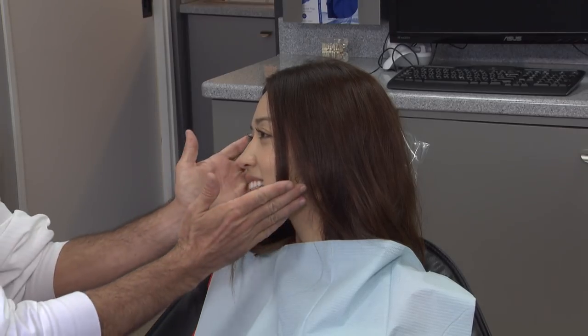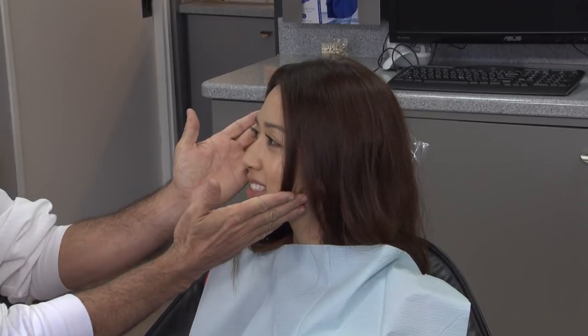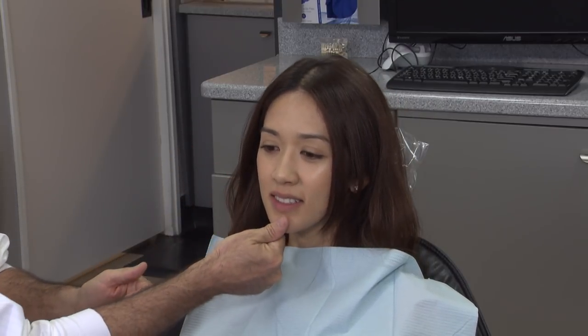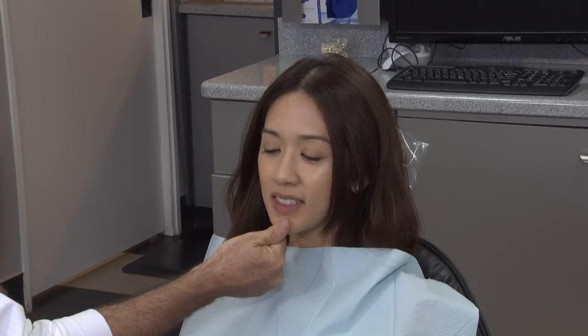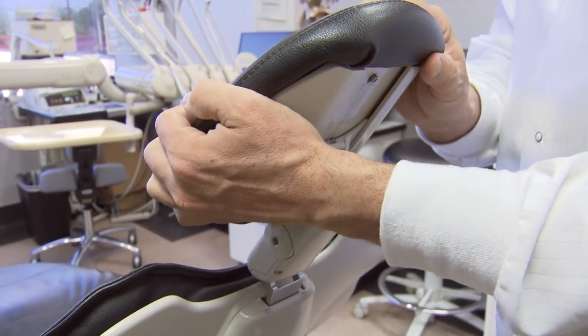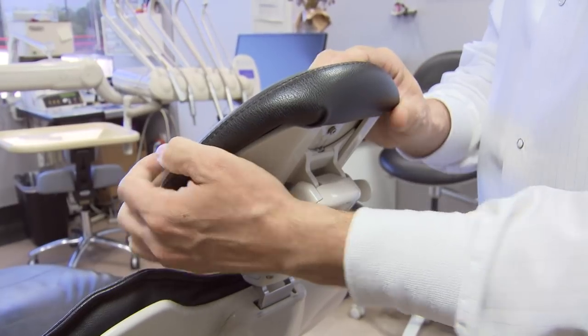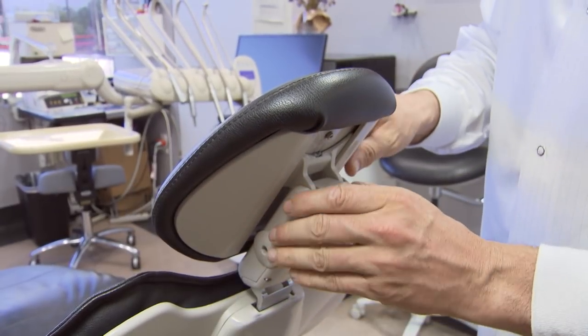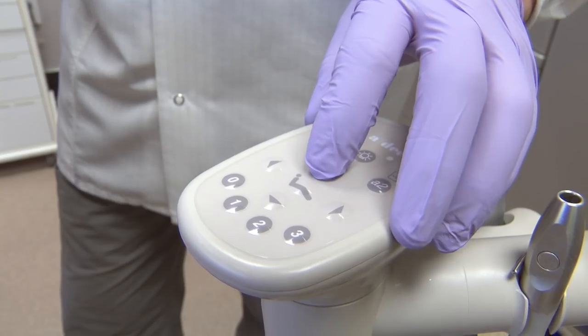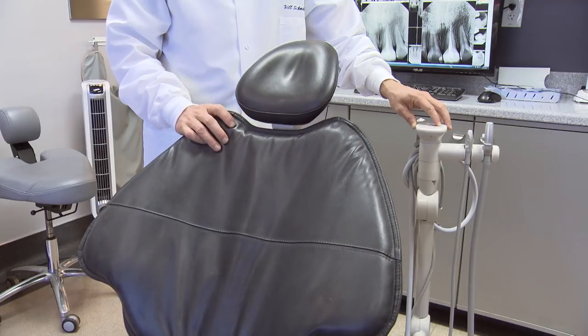Make micro-adjustments to the patient's head positioning by tweaking the angles, tilting the chin up and down, and straightening the head to minimize the need to adjust photos later. If the head is still positioned on the head rest, slight adjustments to the chair allowing the patient to rest the head and make a steady base is advisable.